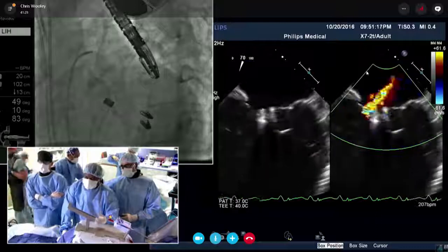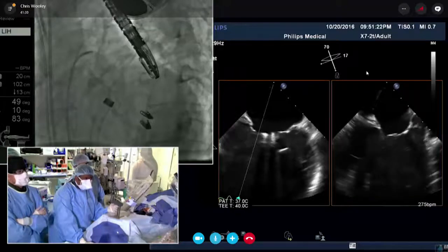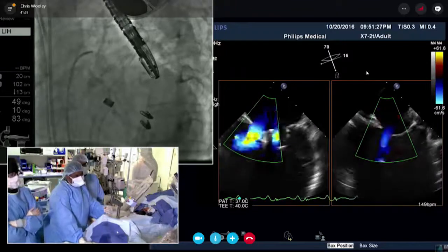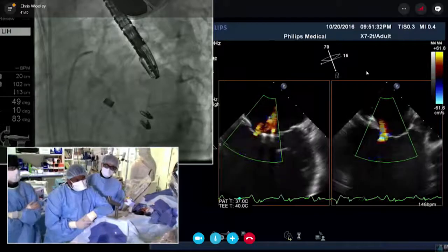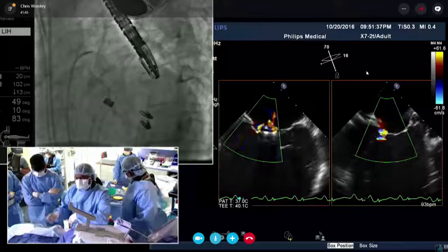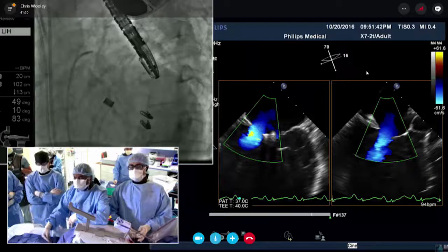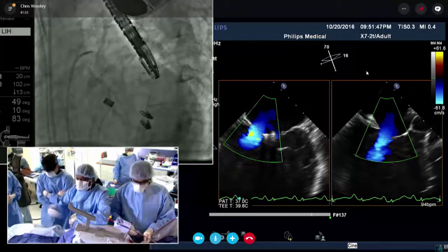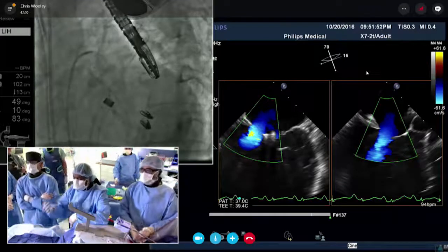And as you know, if LV size reduces, there's a reduction in wall stress. If you have a reduction in wall stress and LV size, to me, that is the most important thing. I've done a lot of cases in COAPT, and what I found very impressive is that when patients come to us with low blood pressures, we do the MitraClip, their blood pressures go up, and now they tolerate their medications, which they could not. Many of these patients who were not tolerating any ACE inhibitors or beta blockers suddenly have higher pressures and start tolerating them after MR reduction.